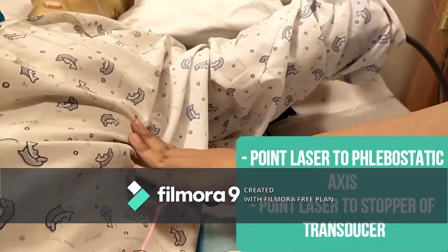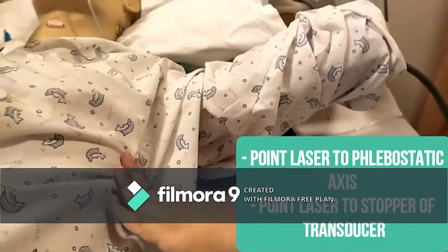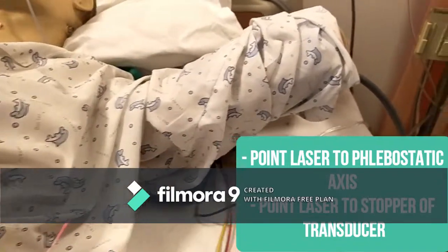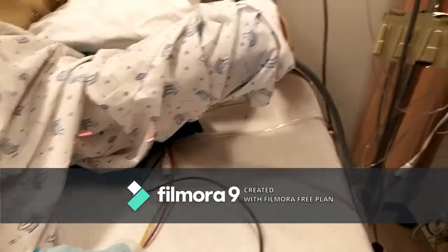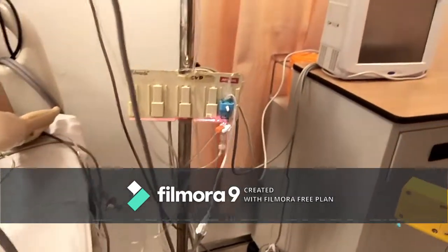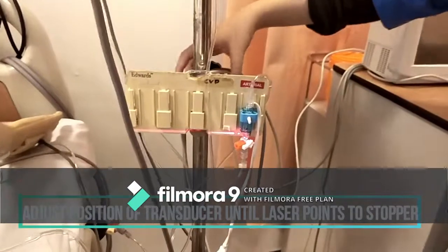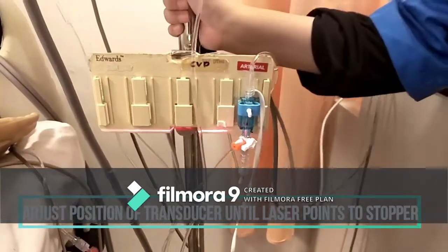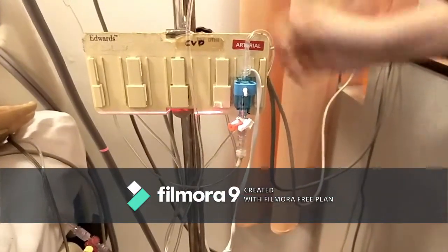Point the laser to the phlebostatic axis. Adjust the position of the transducer until the laser points to the stopper, indicating it is parallel to the phlebostatic axis.